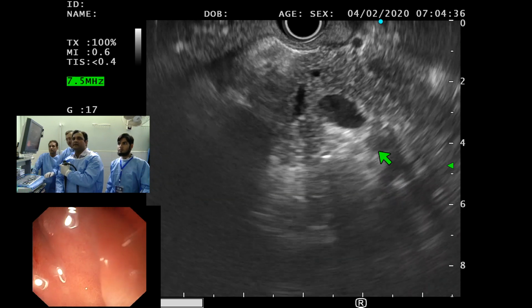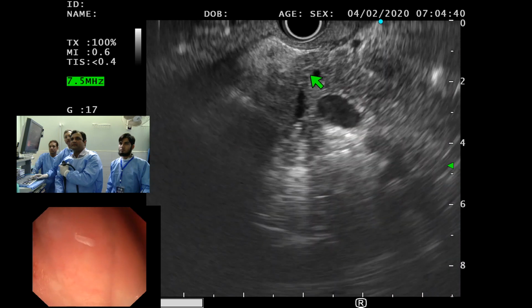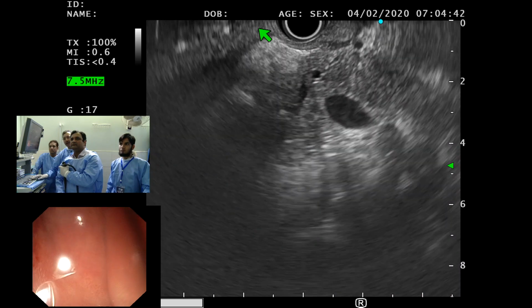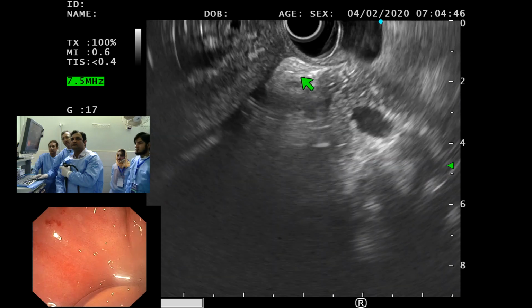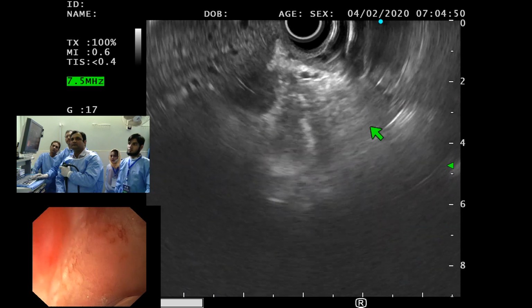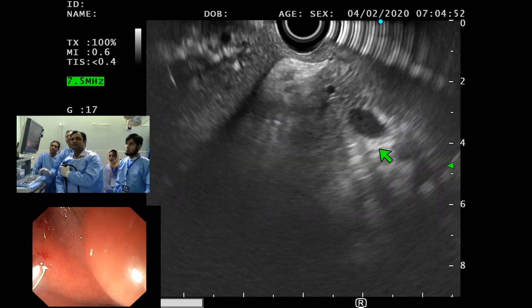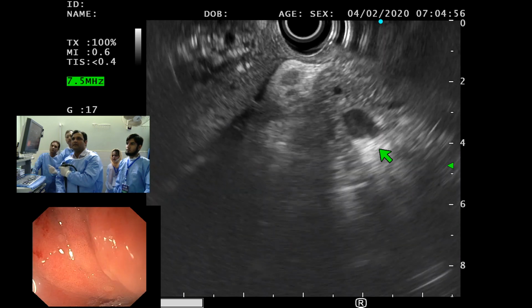Now this is the PD. We are back to the same place, but we want to see the stent and CBD coming from this direction down here. Outline the stent, go a little to this side and then lift.